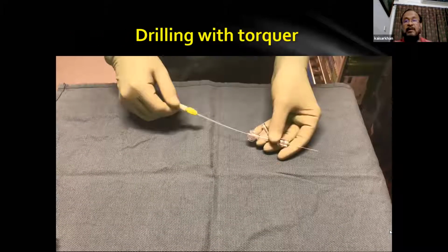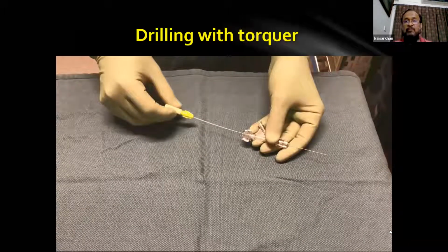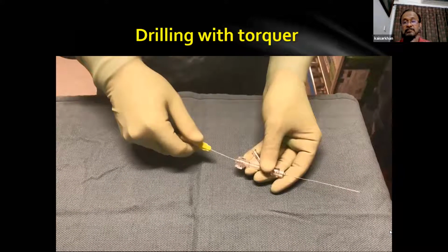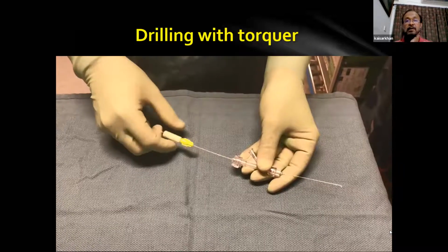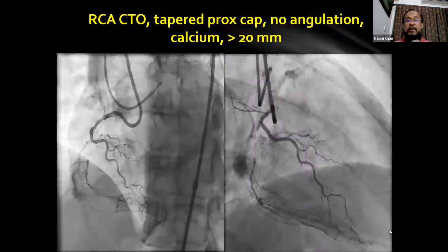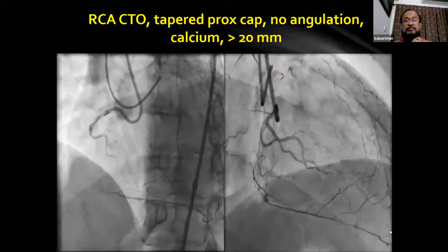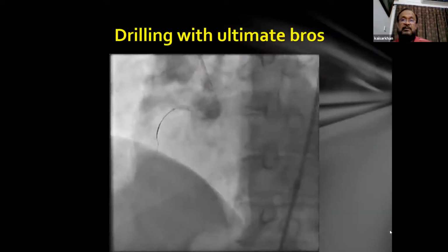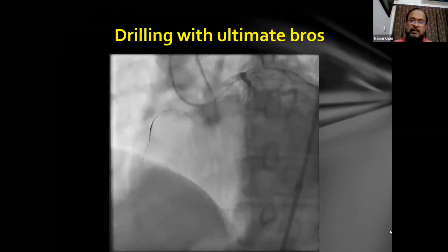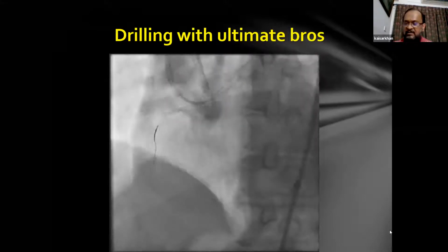This is, you can see the drilling method. You're drilling through the CTO lesions, drilling with torquer. So this is an example of a drilling method. You can see RCA CTO, tapered proximal cap, no angulation, calcium, more than 20 millimeter. And here with the support of a microcatheter with Ultimate Bros, which is a very good wire, you can see you drill through the CTO lesion. It is like Miracle 3 or 6.